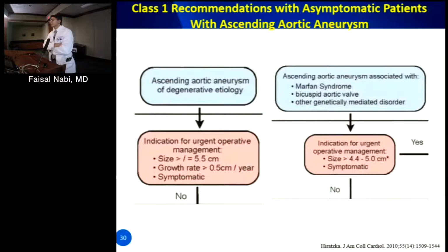What would be the number that you report? Is there any prognostic significance for an aorta that gets longer, the length from the root to the renals? Because we know the aorta doesn't just get bigger in one dimension; it can get bigger in length. That's a good question, Steve. I have not seen that. With CT, you could easily do a center line.